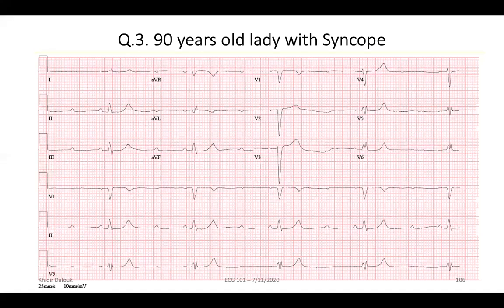So always think about what the top chamber is doing and what the bottom chamber is doing. For example, in ventricular tachycardia, one of the diagnostic tools in the Brugada criteria, some of you have heard about it, is AV dissociation. This relies on the fact that sometimes you can see P waves, but they are dissociated from what the ventricles are doing. This tells you that the top chamber is in sinus rhythm, the bottom chamber is in VT, and they are dissociated from each other. The differential diagnosis of complete AV dissociation includes complete heart block, but it's also VT. VT is another example of complete AV dissociation, but it's just a fast rhythm.